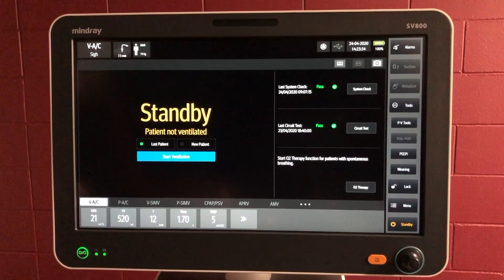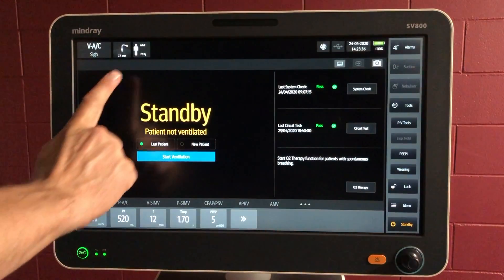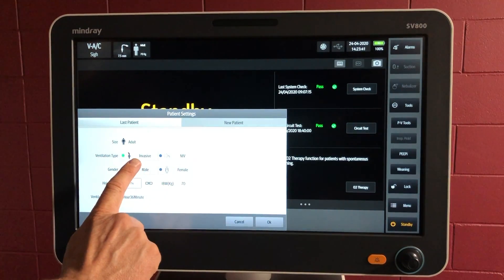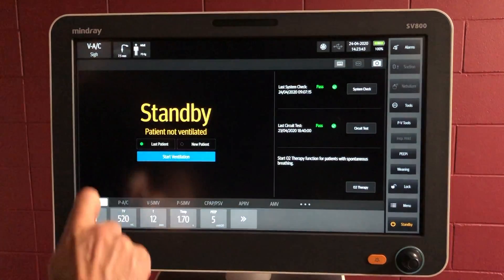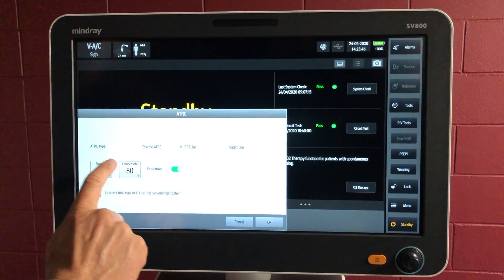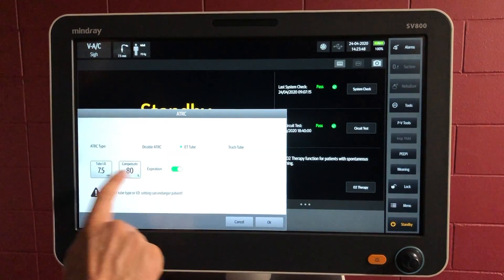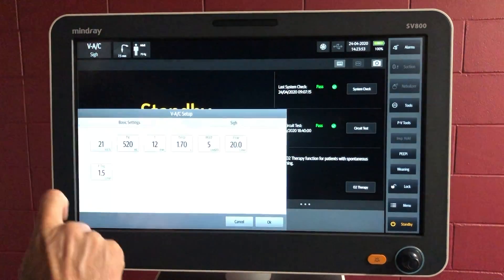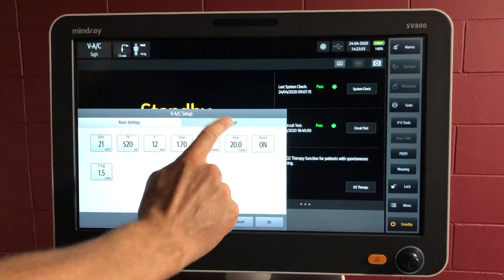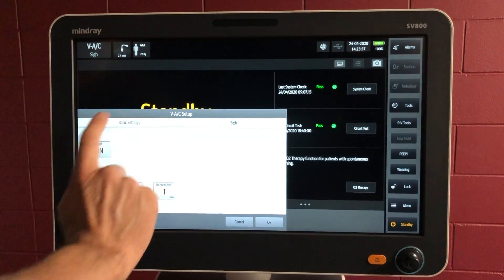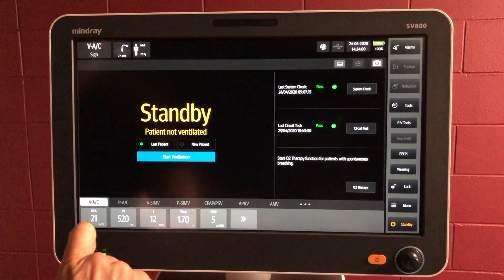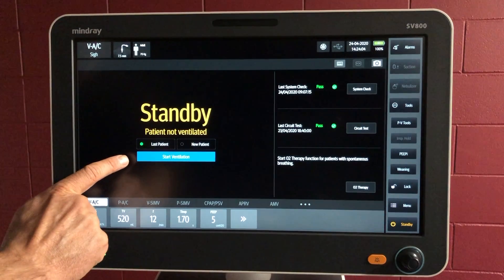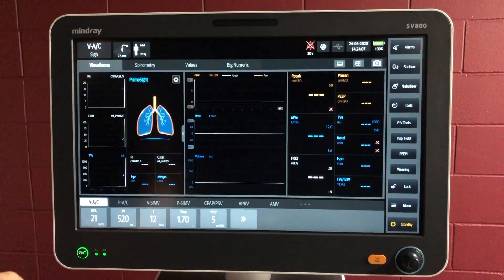So let's briefly recap before we start the intubation. We've gone through to the patient information area and changed things from non-invasive to invasive. We've gone to tube resistance compensation and put that into use with an ET tube of 7.5. And we've gone to the mode, giving it the basic settings as well as a sigh function. So we're good to go — at the moment we're still in standby, patient not ventilated, but as soon as we push the blue button we can start ventilation. Let's begin.